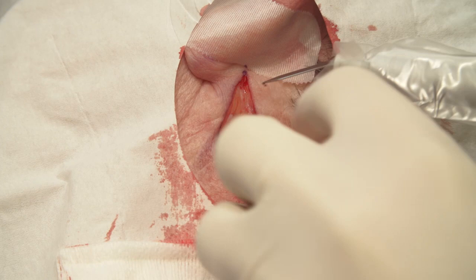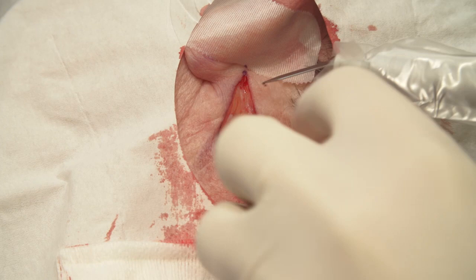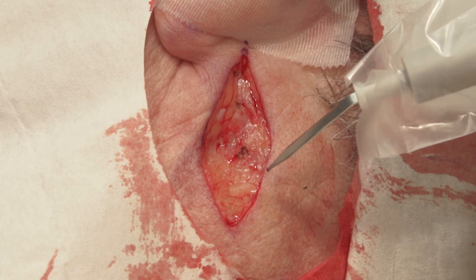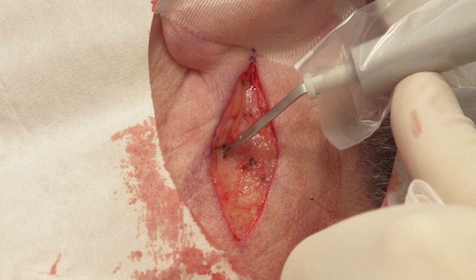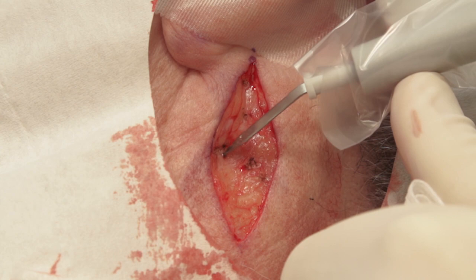After the elliptical excision of a basal cell carcinoma, the hyfrecator with a sterile sharp-tip electrode is being used to stop the bleeding. Each bleeder is electrocoagulated, and cotton gauze is used to dry the bleeding areas for better visualization of the pinpoint bleeders. The power setting is 18 watts on low. A sterile sheath is covering the hand-control pencil.